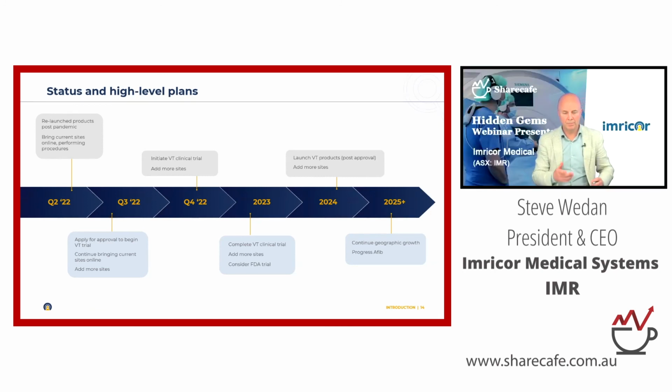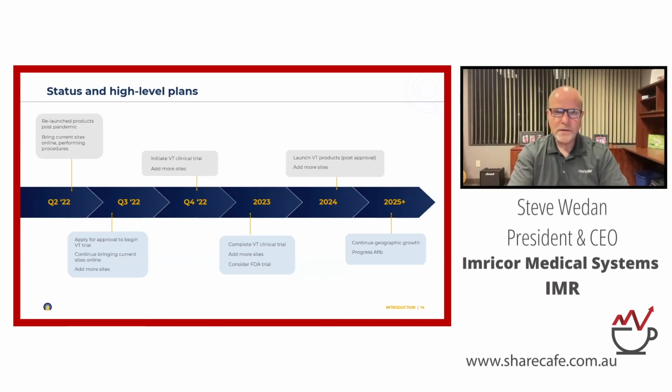And there's a question here, which states, as mentioned in one of your previous announcements, are your consumables compatible with conventional X-ray machines? They are. They're not quite as useful in conventional X-ray machines, but especially our miscellaneous equipment like sheaths and transseptal needles, not so much the ablation catheter, which is very specialized because we use the MRI system itself to track it, and there's technology that allows that to happen only in the ICMR lab. But other devices, we make sure that they're conspicuous in X-ray and that they can be used to deliver other devices in that X-ray EP lab.